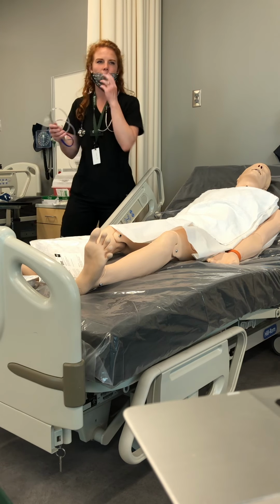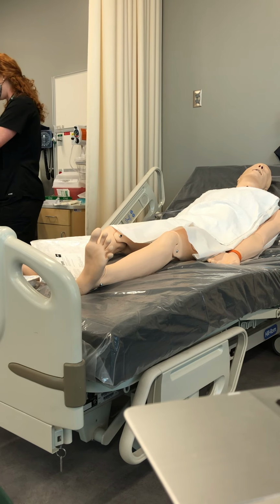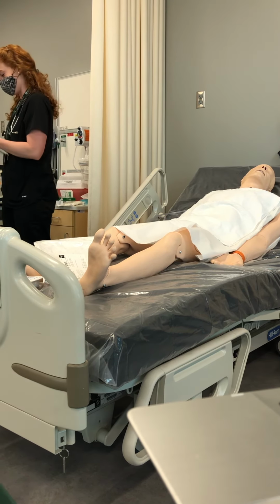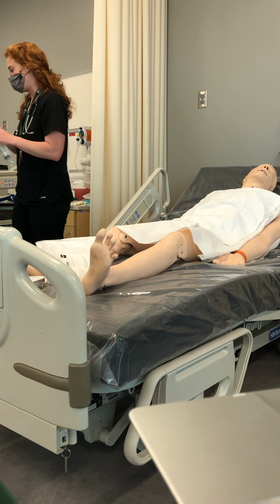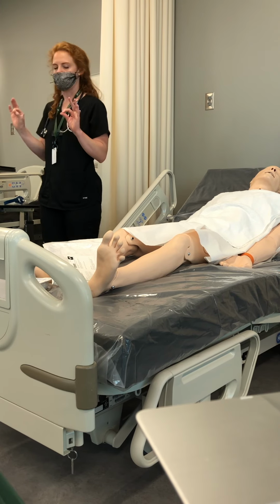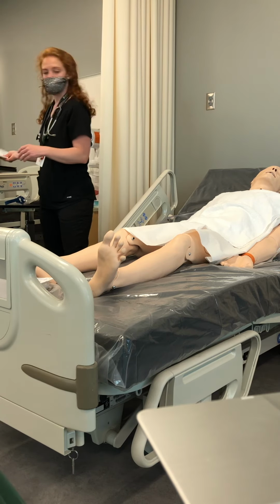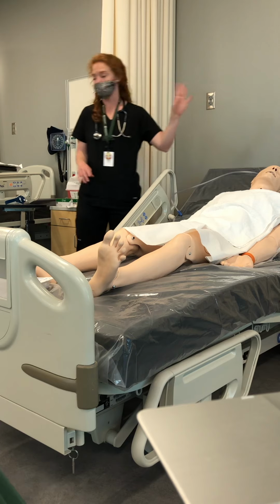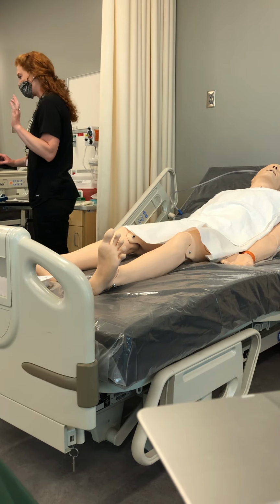It's not like you lose a pair of sterile gloves every time or something crazy, which we will with the, hopefully, I hope that there's a pair of sterile gloves in that catheter tray, or the trach tray, I don't know. But because we're not working on an actual patient and I've already seen you use sterile technique, I'm not going to be as nitpicky with it because I know that you already know how to use it. So I'm actually going to need this anyway. So you will still need your suction for your trach here.